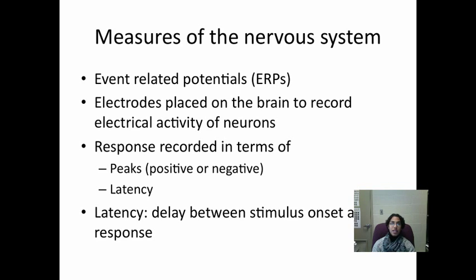There are short latency event-related potentials. There are long latency event-related potentials. Short latency means between the stimulus onset and the response is going to be very short. Quickly you'll get a response, versus a long latency, where the time from the stimulus to the response is going to be longer.